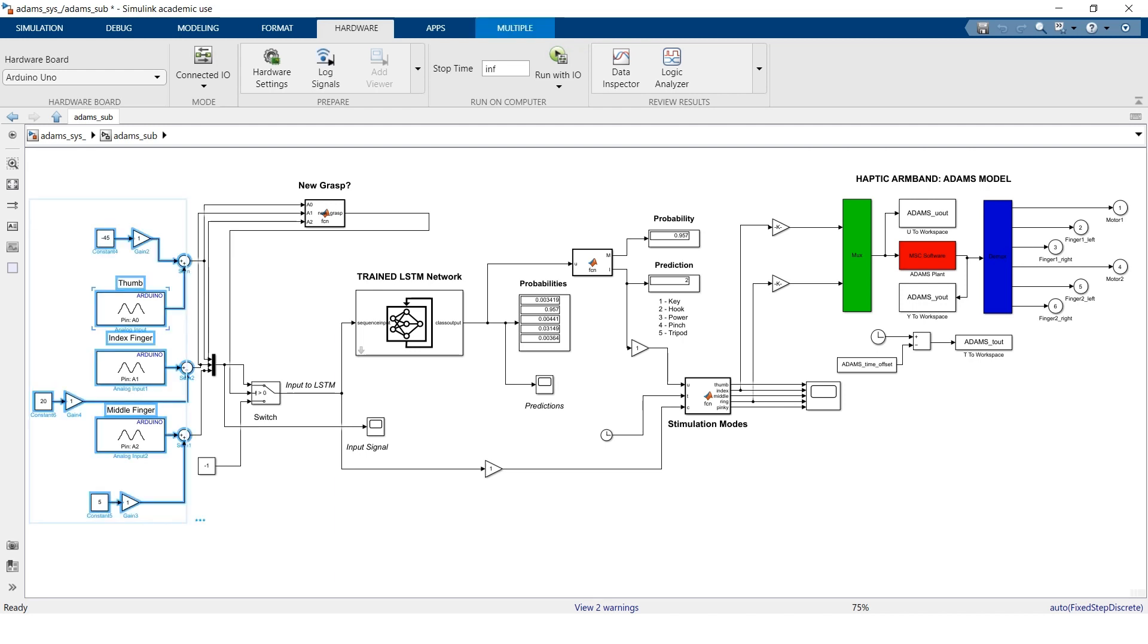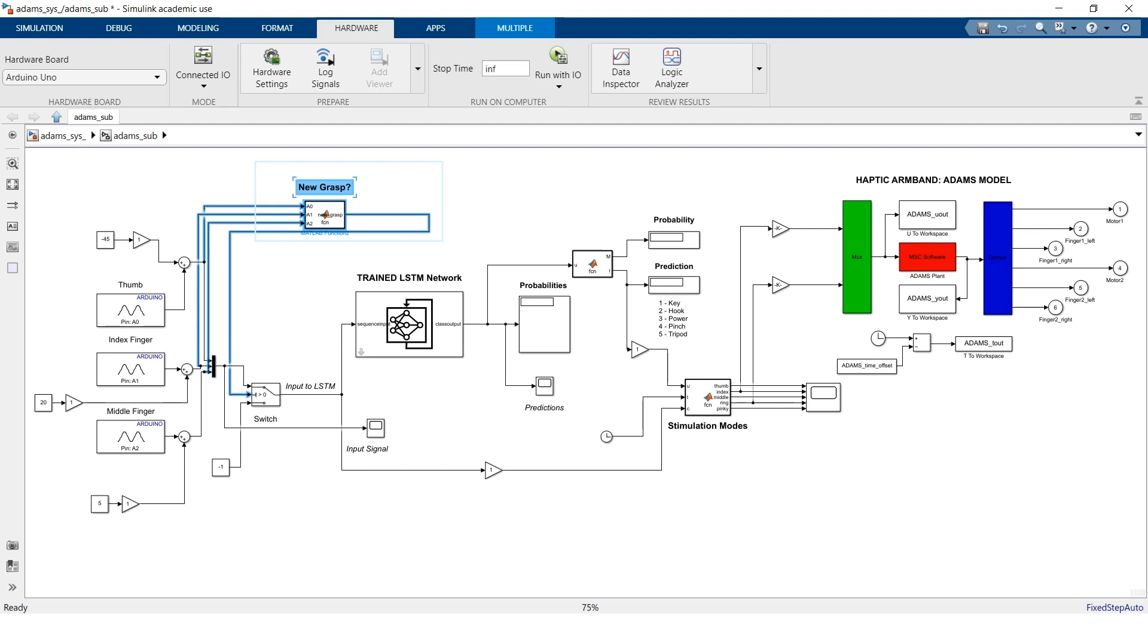We have an input block to collect the sensor readings. We have a MATLAB function which will determine if a new grasp is initiated. If the answer is yes then the sensor readings are sent to the LSTM network to produce a prediction. If the answer is no then we ignore the prediction and maintain the current output.